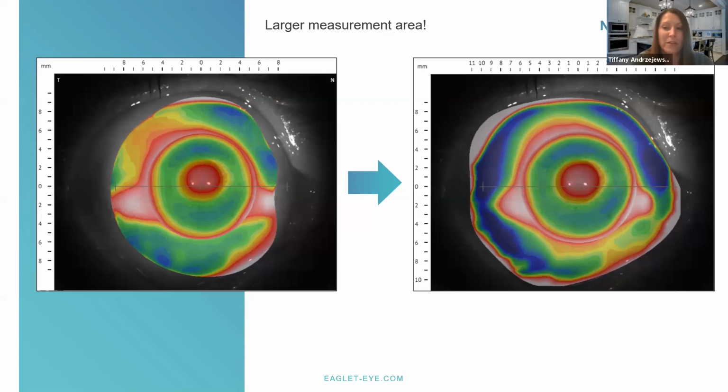So I don't know if the lens is manufactured yet. They're being manufactured as we speak through iPrint, doing a ScanFitPRO. But as Reinier showed earlier in today's lecture, it really makes a big difference once we reprocess that data. So I don't know about you all. I've certainly been frustrated, saying I'm doing all I can to get these images, but no matter what I do, it's just not working. So I think you guys are going to be really, really pleased with what we're going to see moving forward in this new edition.